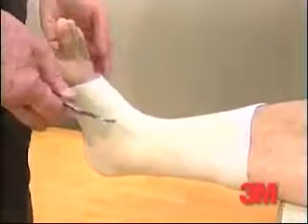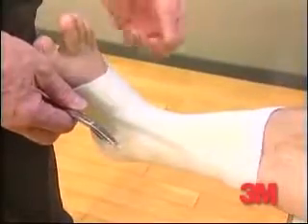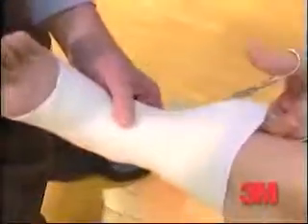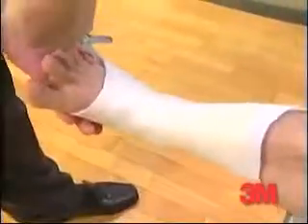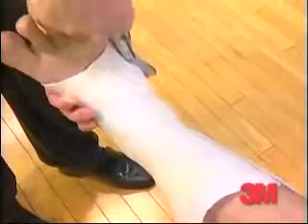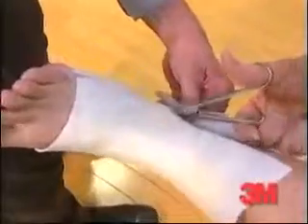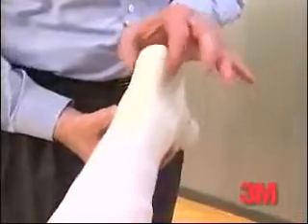For removing the soft cast ankle wrap, there are two ways it can be removed. You can find the end and simply unwrap the material until it's off, or you can simply use your scissors and cut. So you can see the ankle wrap in terms of the molding and the conformability around the Achilles area.